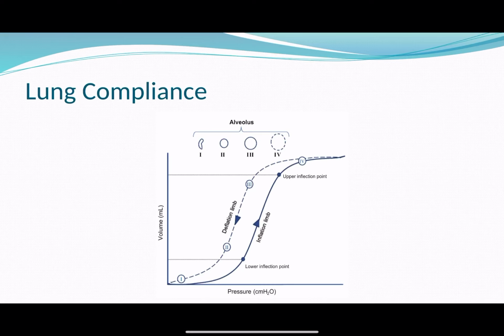Now, another really important concept in APRV is that of lung compliance. I want you to take a little while to just have a look at this graph here. This is a so-called volume pressure graph, and what it's giving you an idea of is lung compliance.